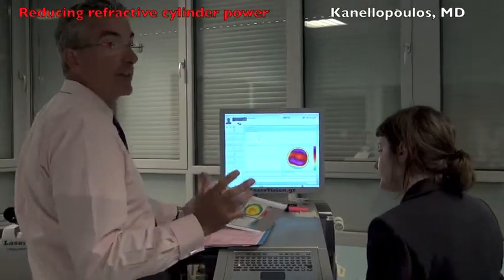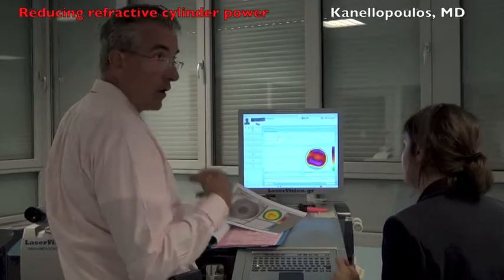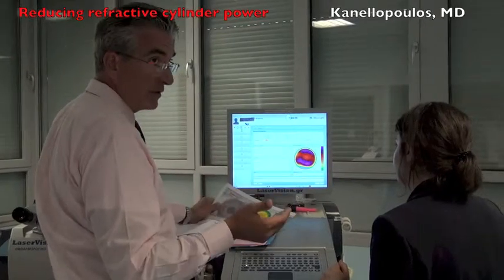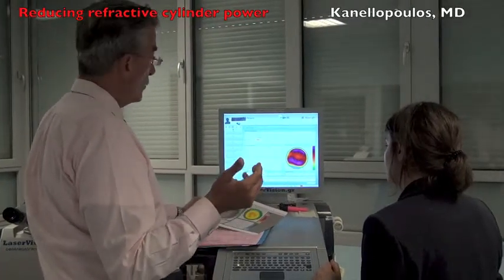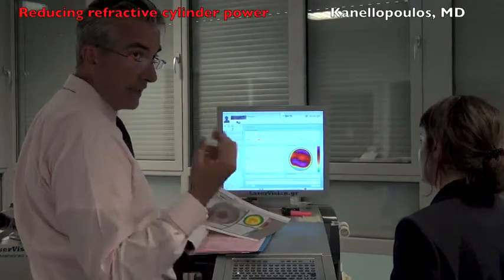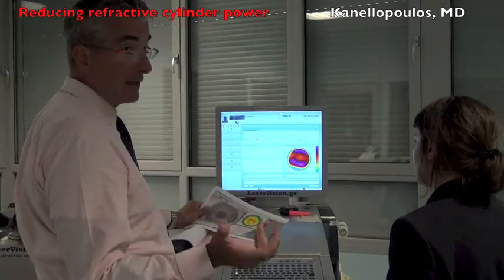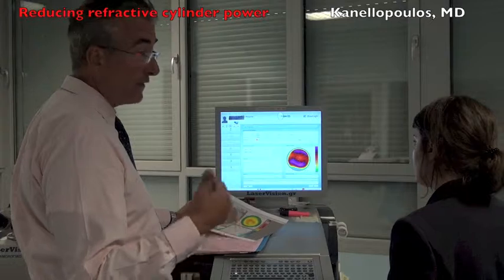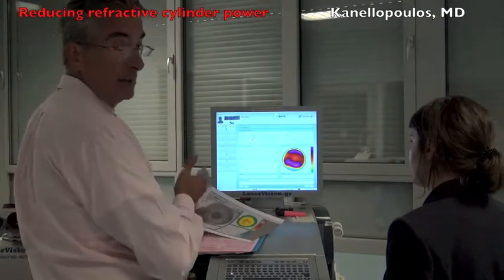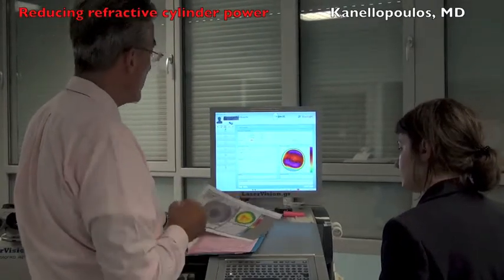Of course, the majority of cases are going to be like the one we just saw. The topography customized platform will suggest treating more cylinder than we're refracting. And we know this is happening because there's accommodative cylinder from the lens of the eye neutralizing the topographic cylinder. But we know accommodating cylinder is not stable, and with time will go away, and we want to treat corneal cylinder with topography-guided ablations in order to get a maximal refractive effect.